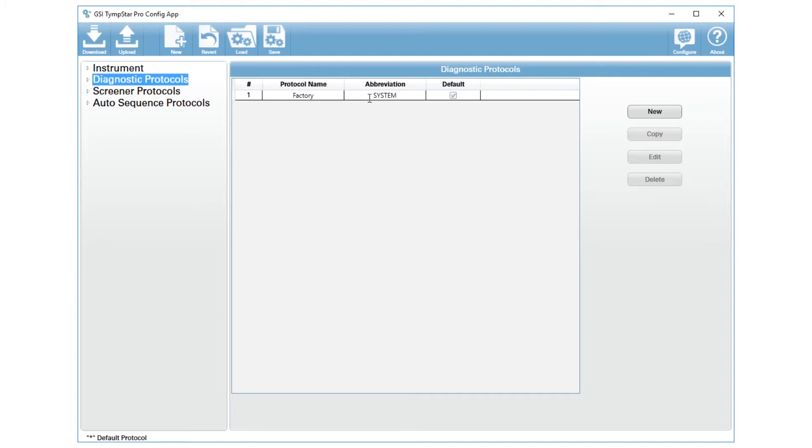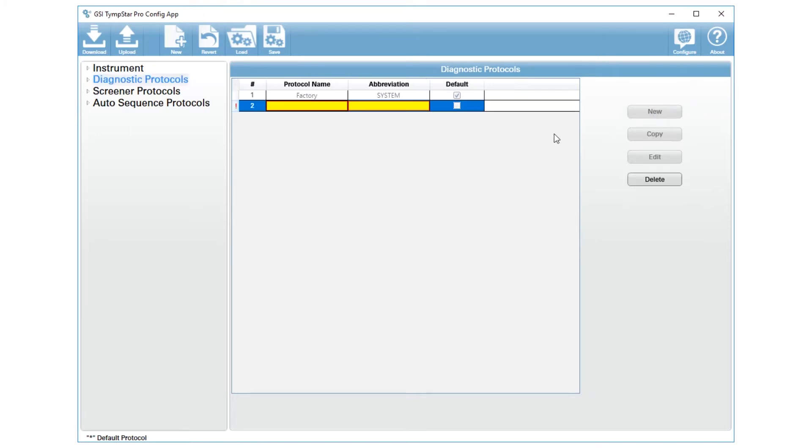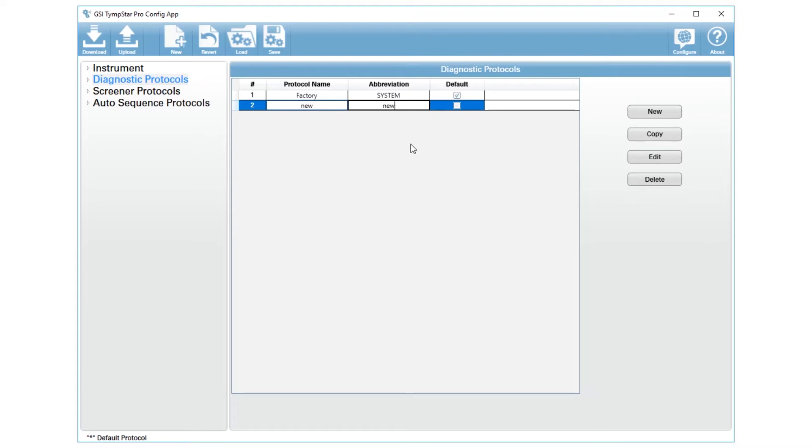So what you need to do is create a new one. Press the new button here, and that will create a blank line where you can type in the name and the abbreviation, and you can make it your default protocol as you move forward.